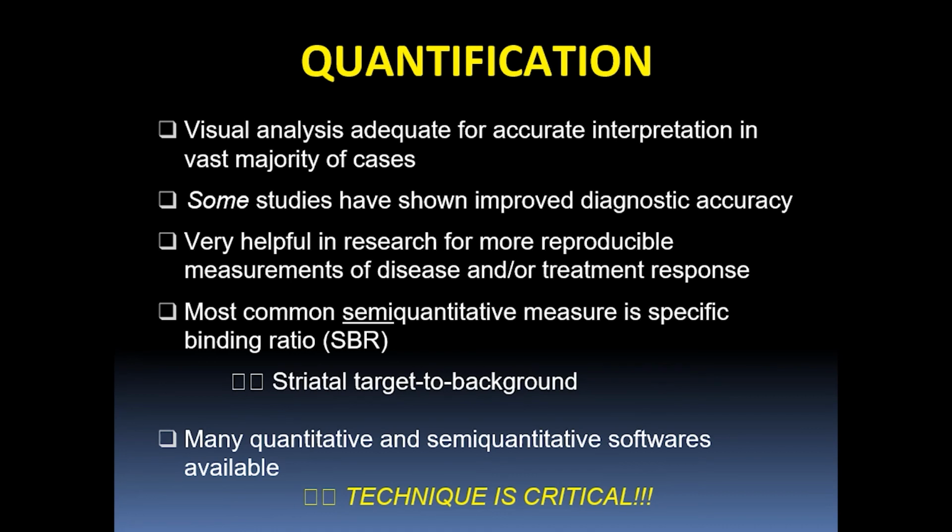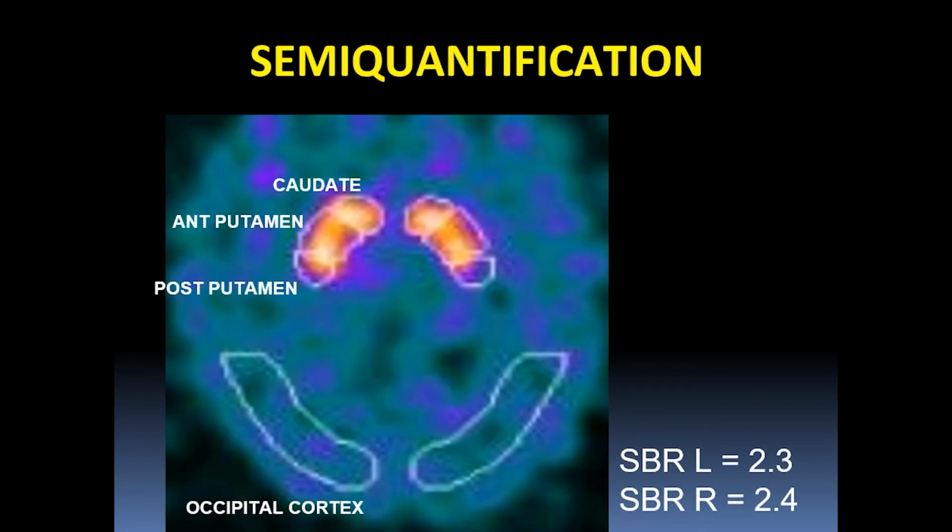The important thing to know is that there's a lot of different software packages available, and they each have unique aspects. So therefore, you need to pay close attention to the one you may be using at your institution and follow their prescribed techniques, because technique is critical.